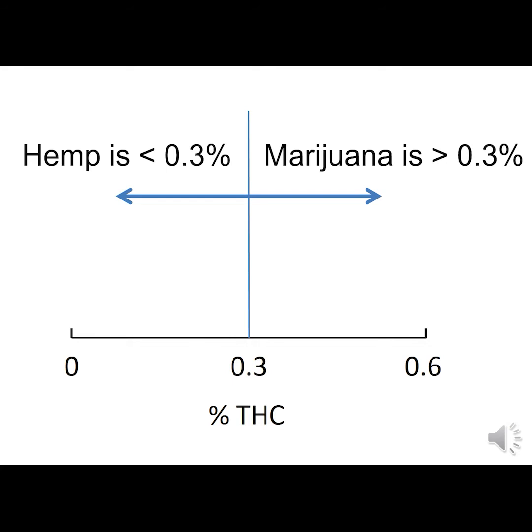But we do not live in a perfect world because of uncertainty. There's uncertainty in a lot of aspects of testing hemp plants. There's uncertainty in sampling the plant material in the field, uncertainty when the sample arrives in the lab. There's a lot of different things that one lab might do different from another that causes variability in what a result is for analysis.